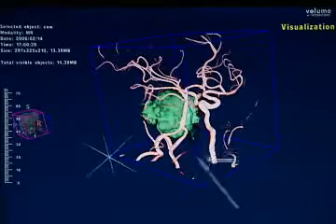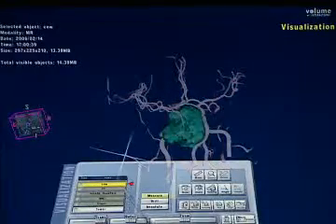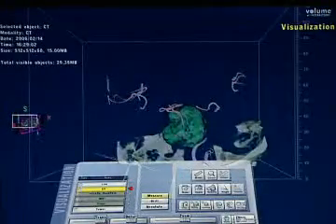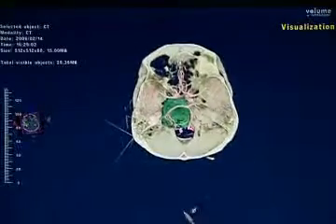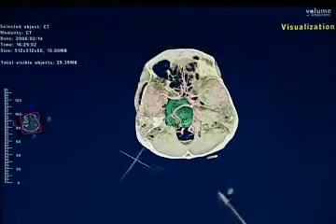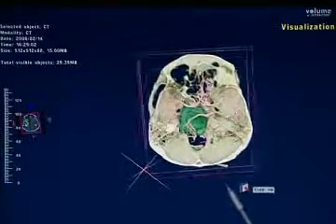So this will be of critical practical importance when you're planning the operation. The other situation of great importance, of course, is the perspective of the lesion with regards to the skull base. If you're going to do a petrosal approach and you're going to do a mastoidectomy, it'll be useful to know how pneumatized the mastoid is.